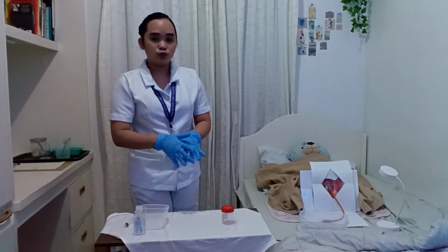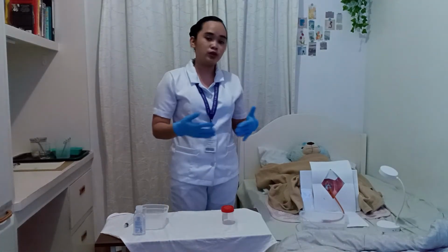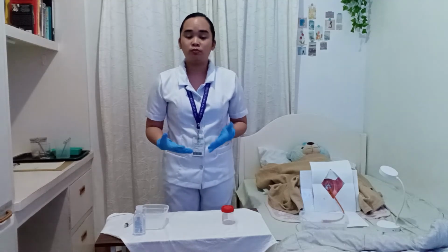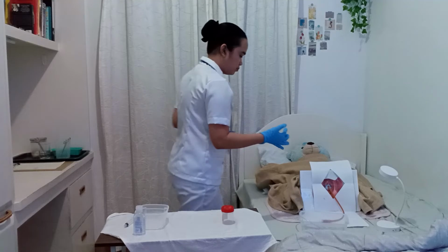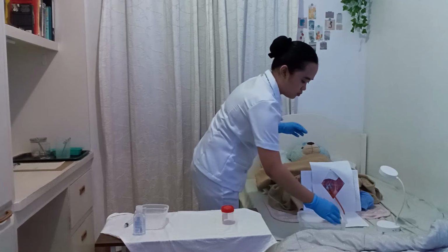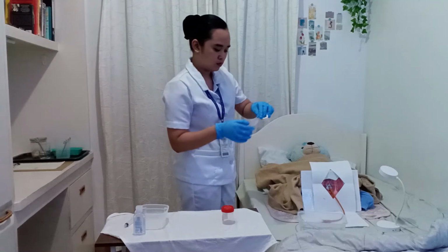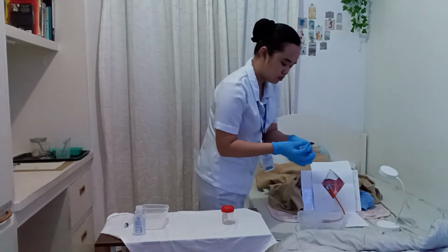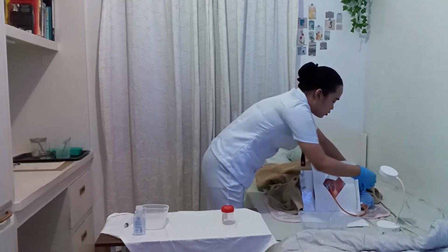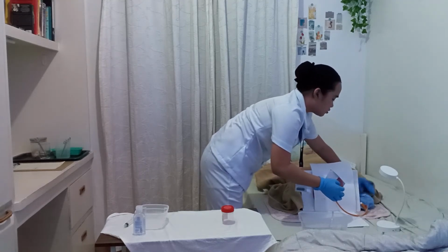Okay, so now I'm going to secure the catheter by taping it on the patient's thigh. Okay, so we're going to allow some slack of the tubing to accommodate the patient's movement. Okay. I'm going to take this one. So, ma'am, are you comfortable with this? Alright.